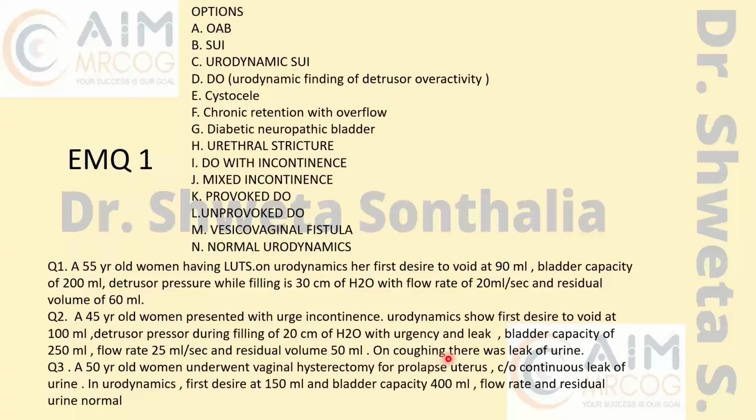So this coughing, there is overactivity or not? They are telling both, so maybe it is a mixed one. They are not mentioning detrusor overactivity, so you will assume that there was no overactivity while coughing.